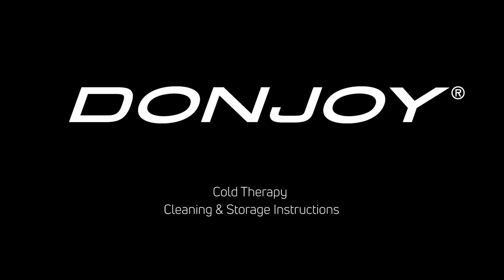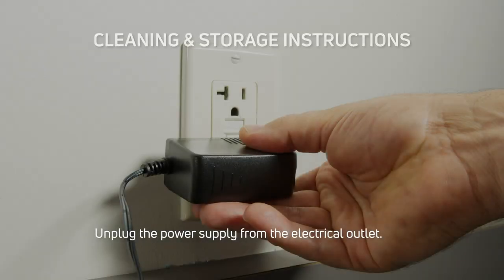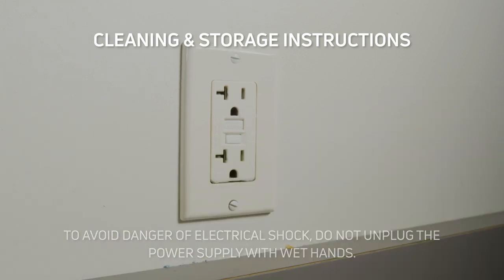Instructions for cleaning and storing your cold therapy unit. First, unplug the power supply from the electrical outlet. To avoid danger of electrical shock, do not unplug the power supply with wet hands.